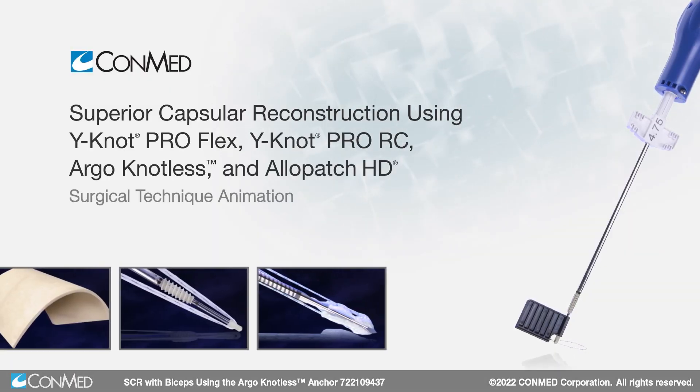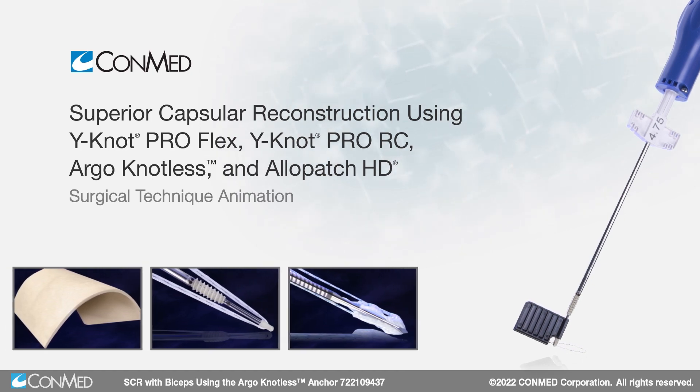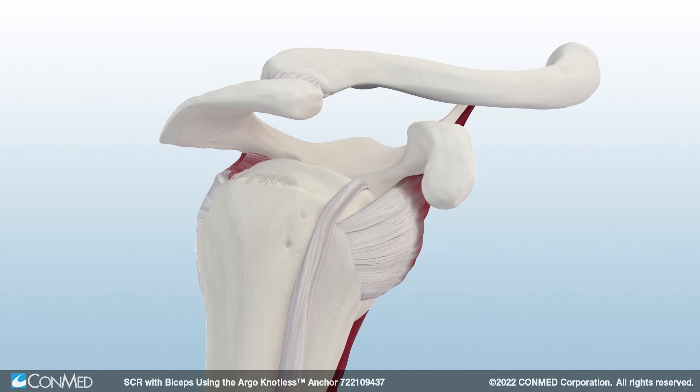Superior capsular reconstruction can be used to treat irreparable rotator cuff tears. To begin, tenodese the biceps tendon using the Tenolock Dual Expanding Tenodesis Anchor.